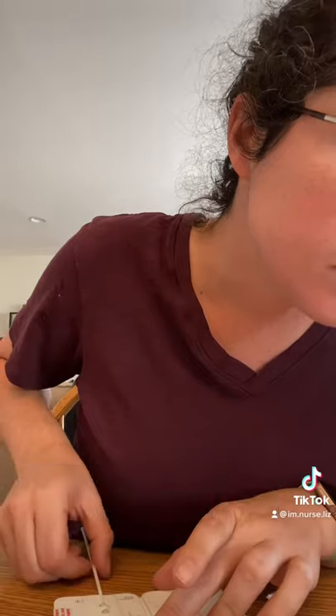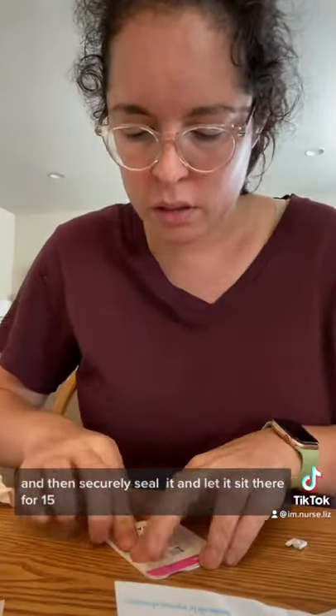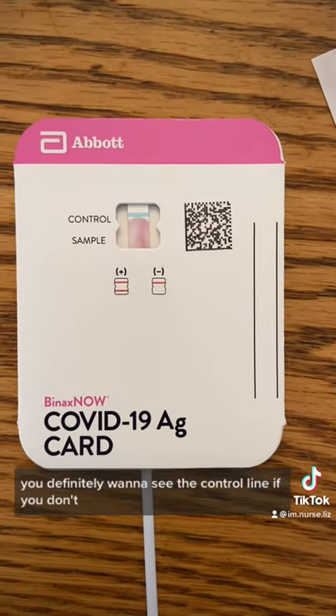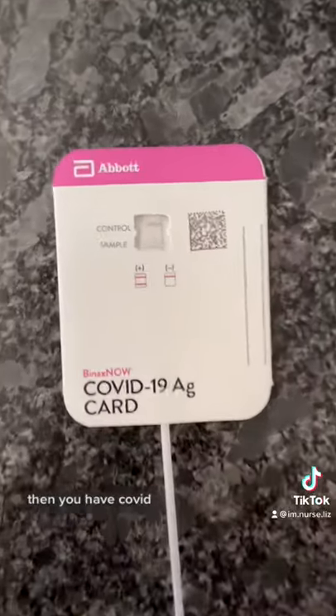Once you're done swabbing your nose, you're going to put the swab back in the card. You're going to want to rotate it and then securely seal it and let it sit there for 15 to 30 minutes. You definitely want to see the control line — that's that little pink line. If you don't, then you've got problems. And if you end up with two lines, then you have COVID.